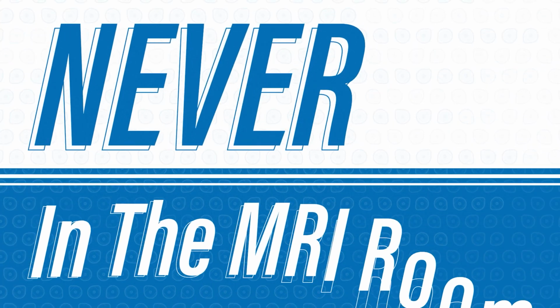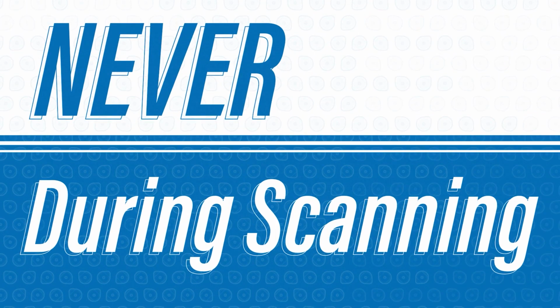MR Unsafe is also pretty easy to understand. This one means it contains some sort of metallic element and it should never be in the MRI room and never be on a patient during scanning.